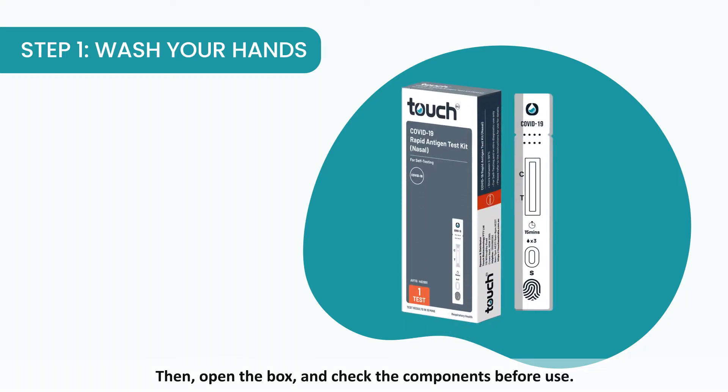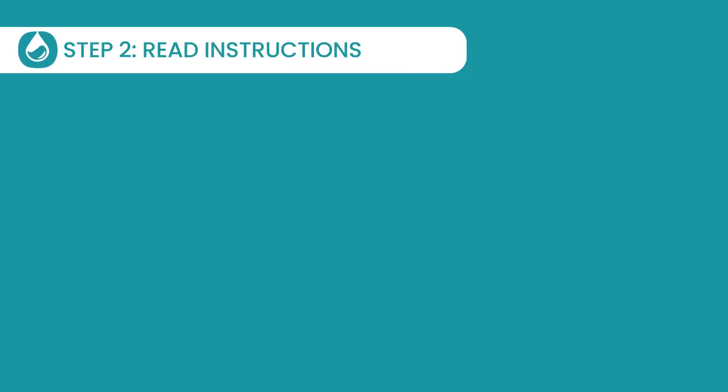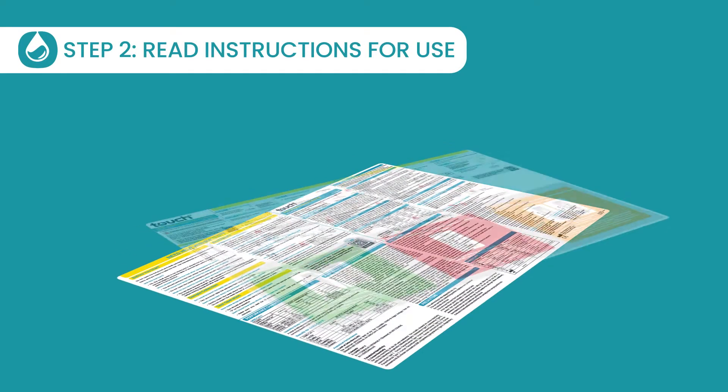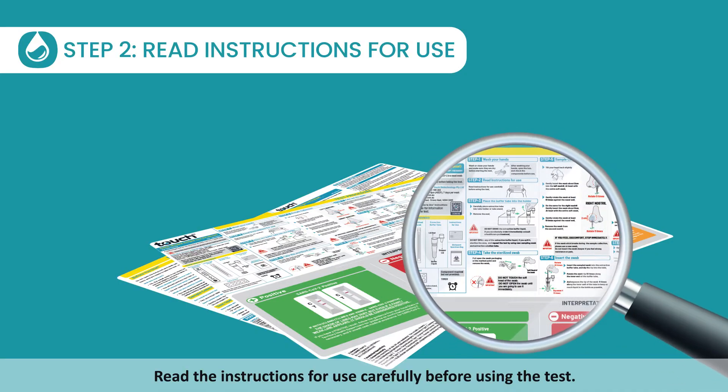Open the box and check the components before use. Step 2: Read instructions for use. Read the instructions for use carefully before using the test.